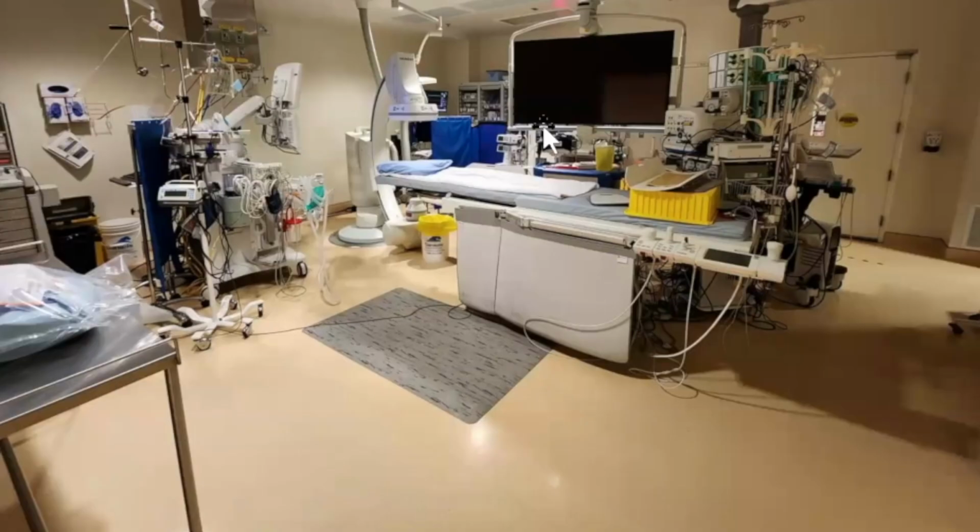But I have this big screen. I stand over here. I have this big screen. You're on the table. We have an anesthetic machine. We have an anesthetist there. We have nurses in that corner, and this is where we do the procedures.